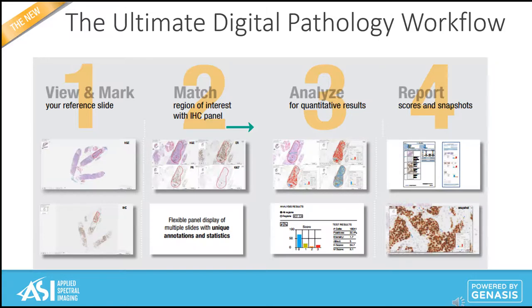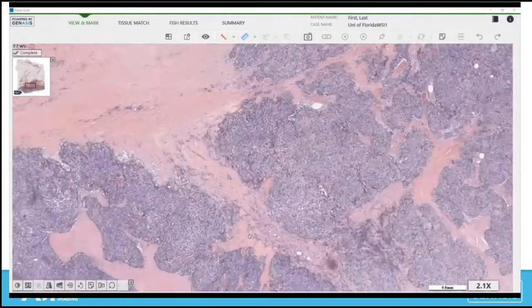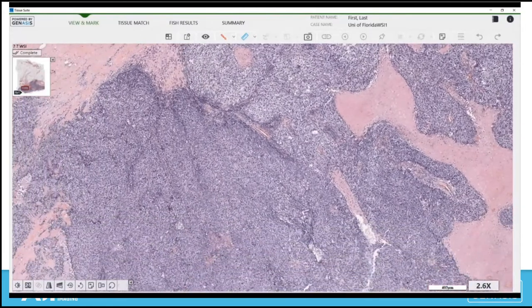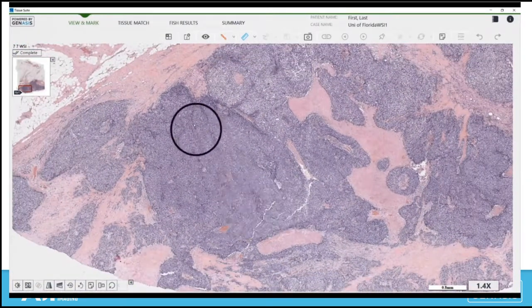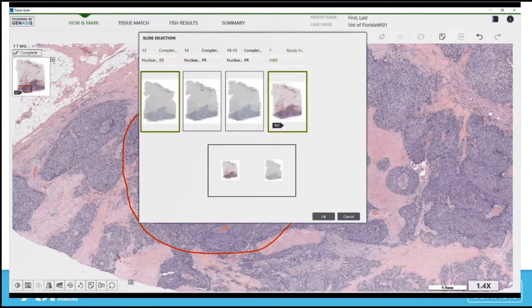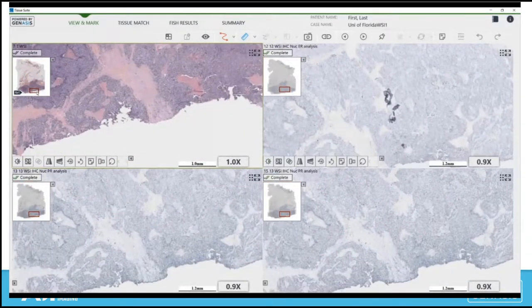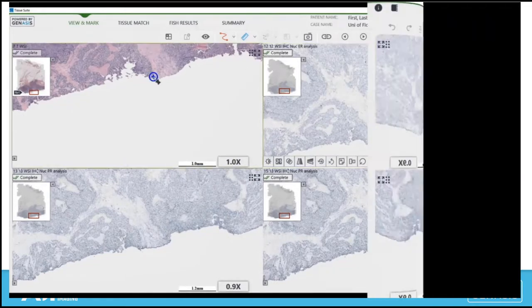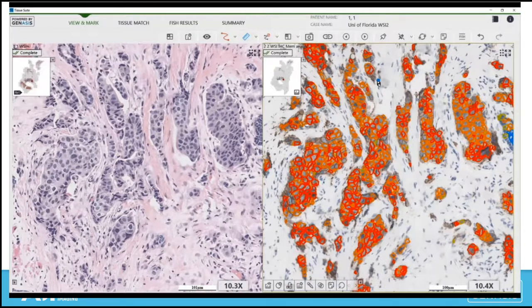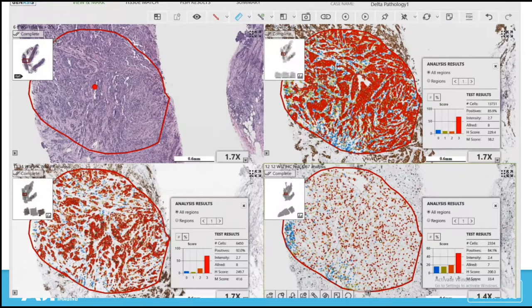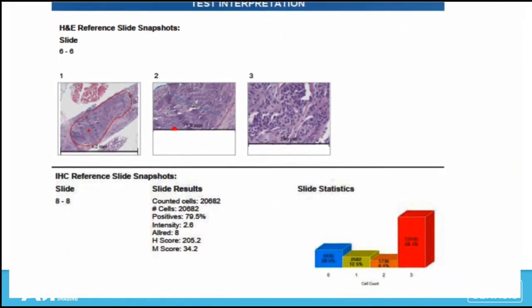Our latest whole slide imaging platform dramatically improves the workflow process and eliminates the tissue matching issue entirely while providing quantitative analysis. After the H&E slide is scanned into the system, the pathologist is able to navigate around the slide and zoom in to a high digital magnification. The pathologist is able to mark, measure, annotate, circle areas of interest, and request secondary tests if needed. After the IHC slides are then scanned in, the tech is able to digitally tissue-match the IHC slide to the H&E, which will automatically initiate the analysis, producing quantitative results. As the pathologist reviews the results, they're able to toggle back and forth between the original image and how the system scored the stains, modifying either specific cells or selecting new areas of interest altogether. Results reflect both the area of interest and total score of the slide. Images are then captured for reporting, notes are made, and the case is ready to be signed out with quantitative results.